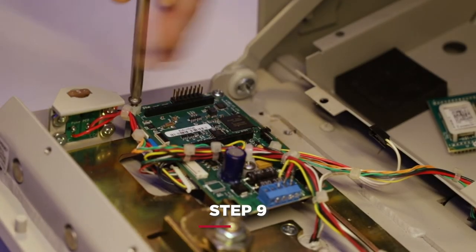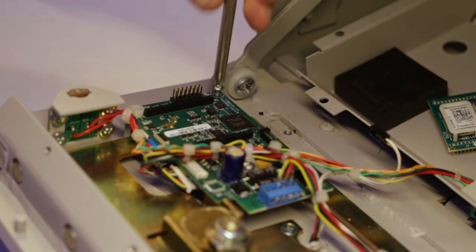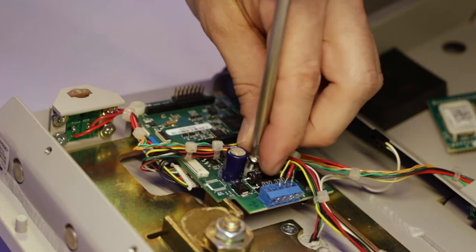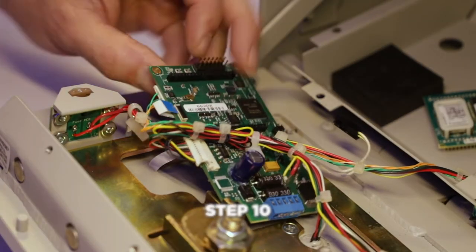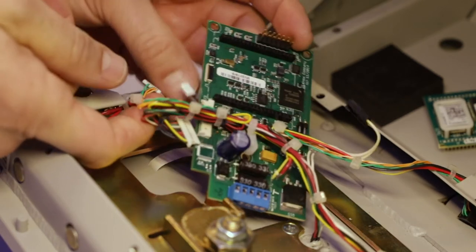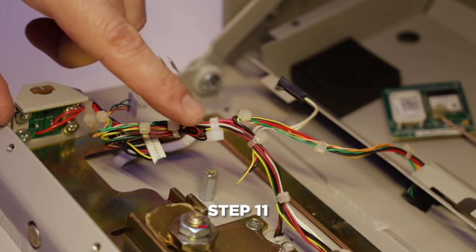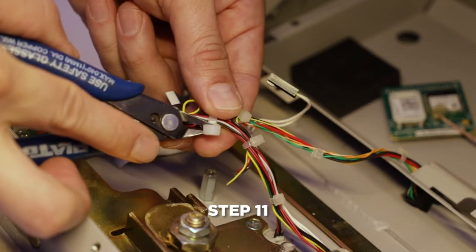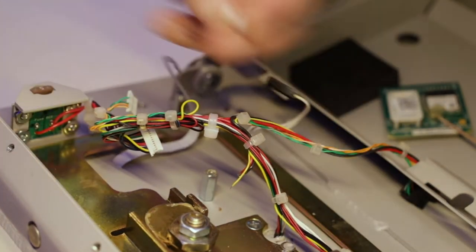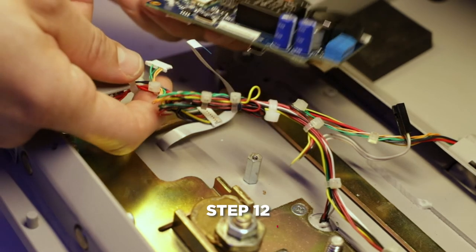Remove the Kapton tape from the keypad display connection and the peripheral IO connector. Use a number two screwdriver to remove the screws from the top of the circuit board. Remove the ethernet connector from the board. Now the old circuit board can be removed from the Medvault. Once the board is removed, snip the cable tie holding the wiring bundle, using a fine point wire cutter so that no other wires are cut.